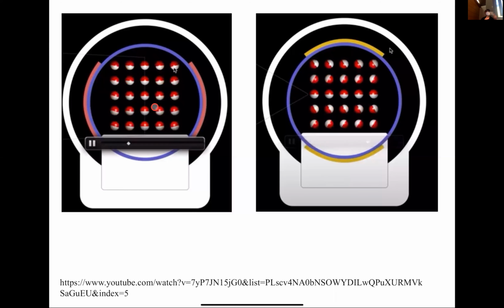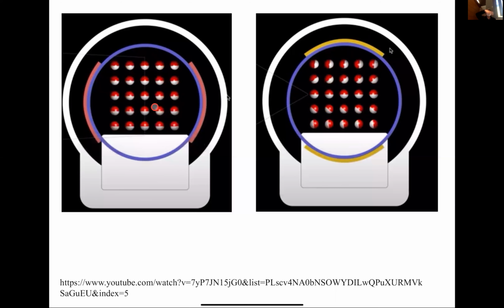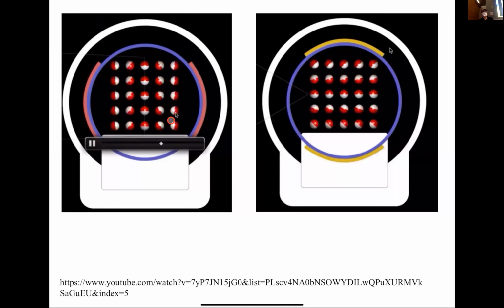What we said is that precession is always clockwise, because we talked about that about 10 minutes ago. Because we said it's e to the minus j theta, the theta is negative, so precession is always clockwise. Then are the spins here precessing faster or are these spins precessing faster?